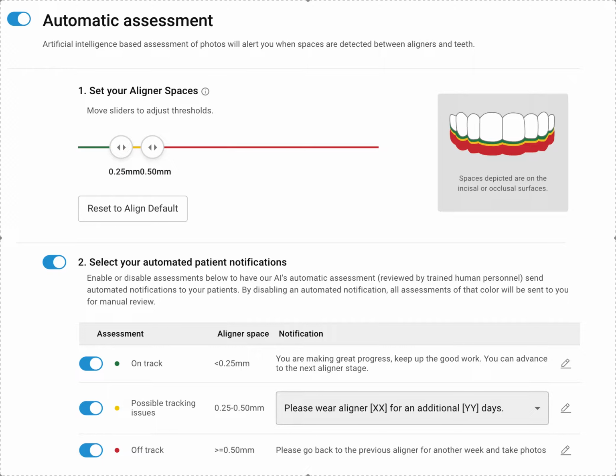And all you guys are always complaining, oh, it costs too much money, it's too hard. Well, now there's a free version. If you're using Invisalign, it's free. You have no reason not to use it. You don't give your patients an option.